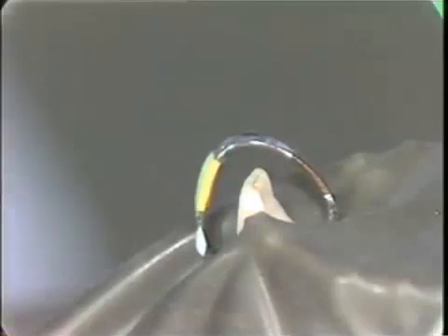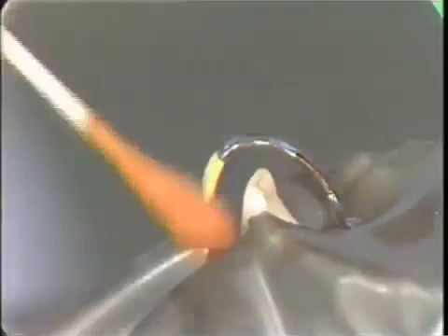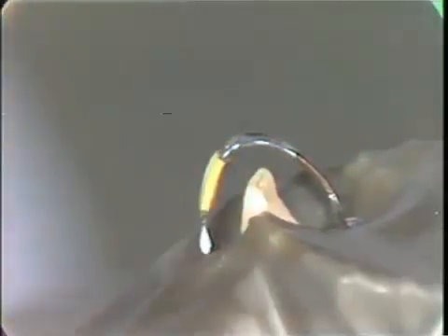We'll be working on a maxillary central incisor, the same as we demonstrated with the models. As I said before, when working on an actual tooth, the first step is to swab the tooth and the surrounding area with tincture of Merthiolate to disinfect the operating field. Then you take a very good look at the crown of the tooth, the angulation of the tooth, and your initial radiograph, and visualize exactly where that pulp is and what your tentative outline form is going to be.